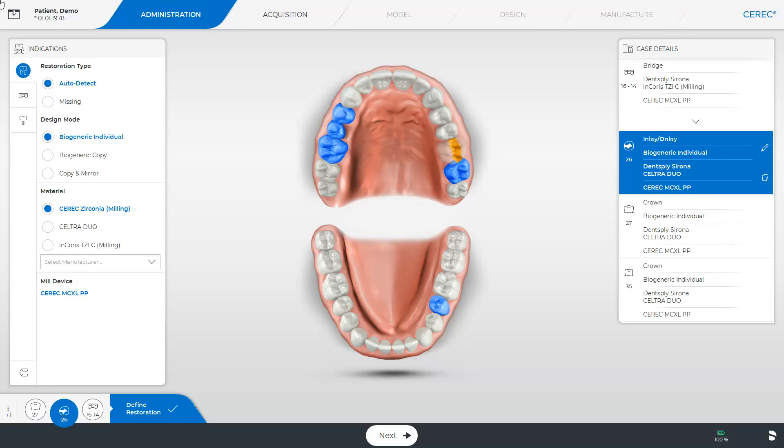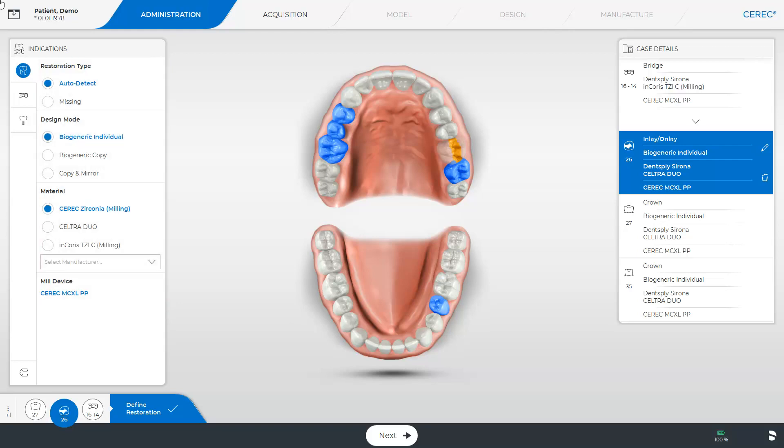The patient has been created and in the administration phase we have selected all relevant settings such as the restoration type, the design mode, the material and the positions within the odontogram. By tapping next we switch to the acquisition phase.